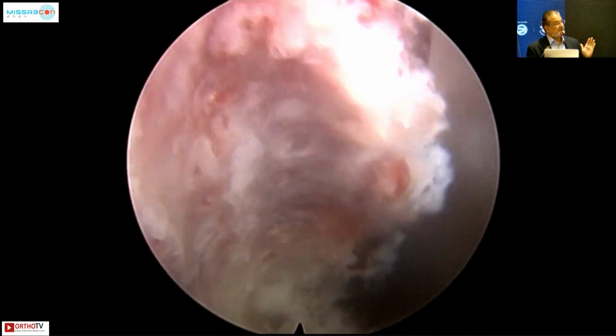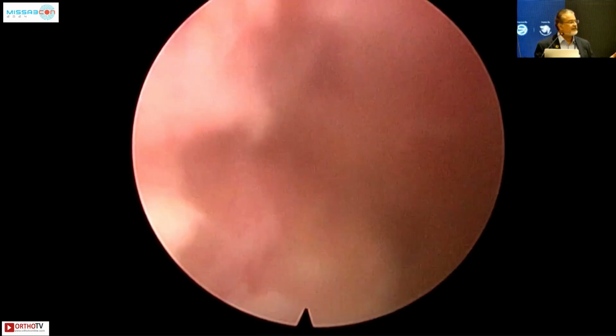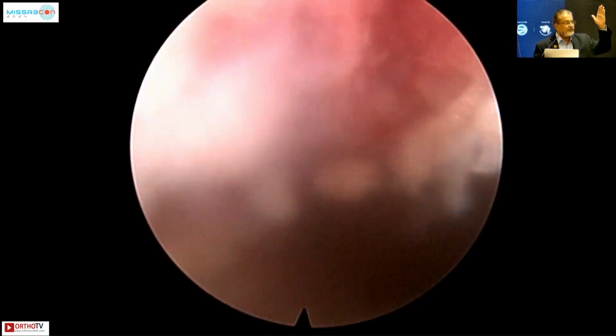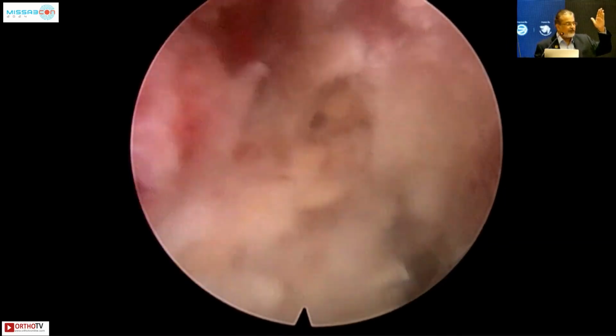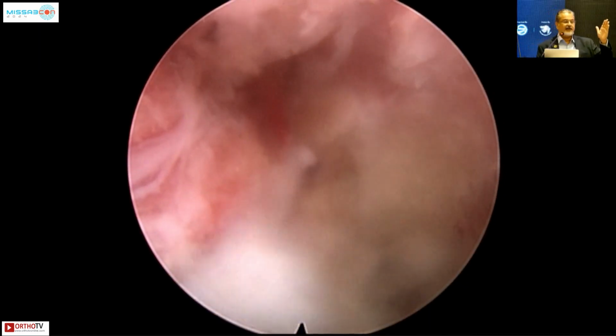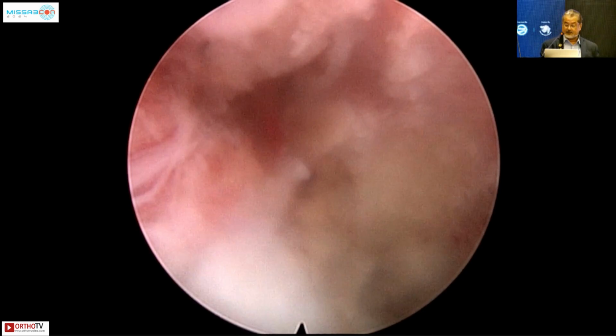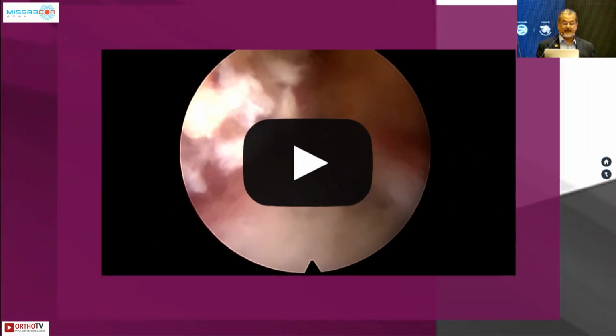and as you take off the ventral part of the SAP, how much do you need to take off? A couple of millimeters is all that is required, because the vertical component of the SAP is going upwards and sooner or later is going to abut against the cranial pedicle and the pathology is going to stop, or the natural history of progression of collapse is going to stop. So it is this much to entirely decompress that area.